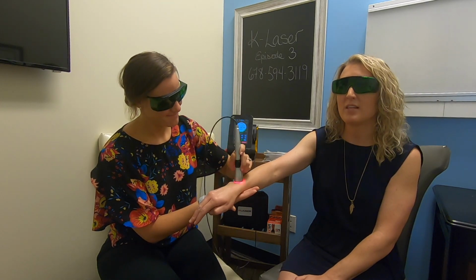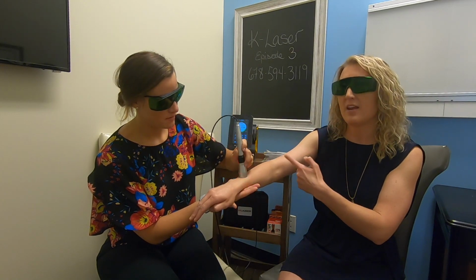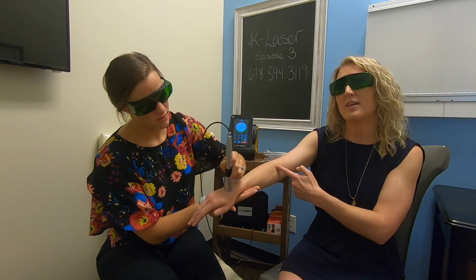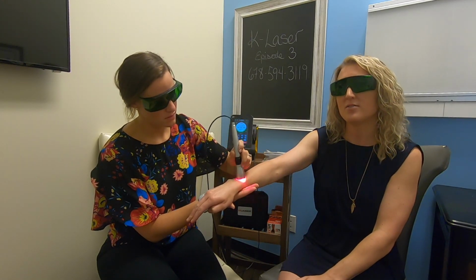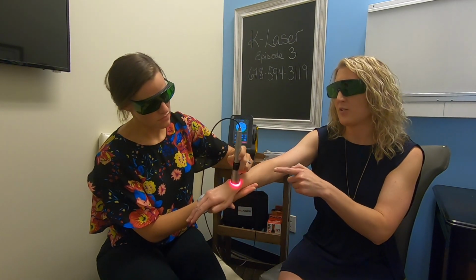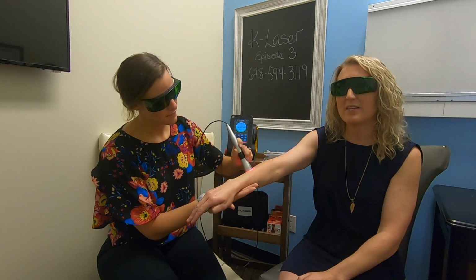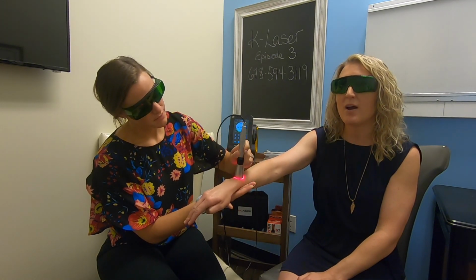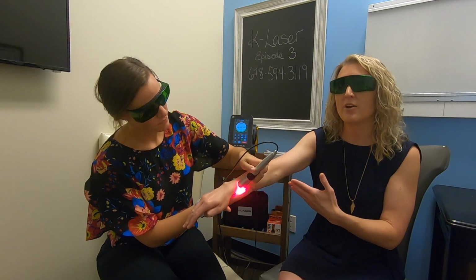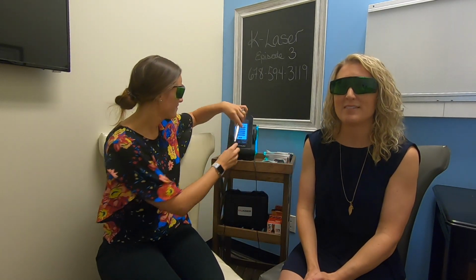This is only a 2-minute treatment, so it's really quick. A lot of times with the laser, you will do a 2-part treatment because most wrist injuries involve the elbow. Elbow injuries can involve the shoulder. Shoulder can involve the neck. So a lot of times you do 2 parts. But with the moving, you can push in some areas to push the nutrients. You can do lines like Bailey's doing, or you can do circular motions to kind of break up the area. And if you do have an acute injury, you can also KT tape it afterwards to keep it in place if you sprained it or moved it. And the treatment's over. That's how quick and easy it is.